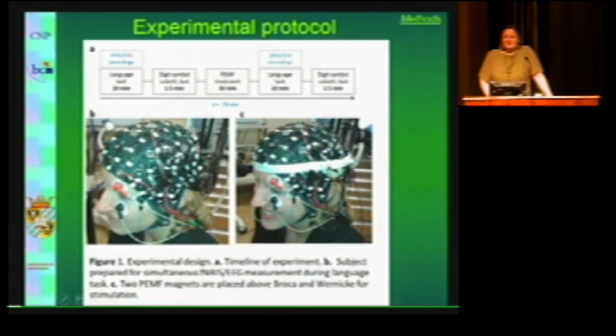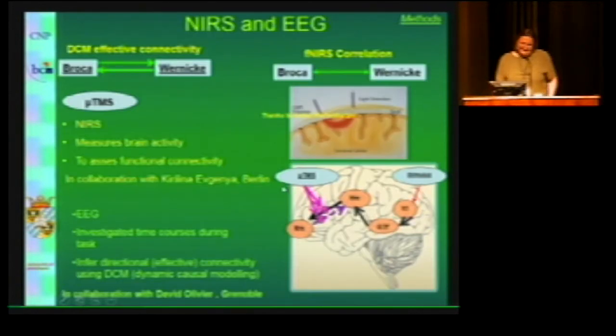is smiling. She has no clue whether we are stimulating her or not. But we also don't know that. And so we are measuring near-infrared spectroscopy. This is the activation of the brain, what we measure is similar to fMRI. And the idea is to assess functional connectivity, so undirected, not knowing the direction.